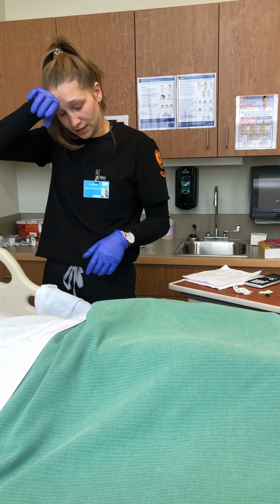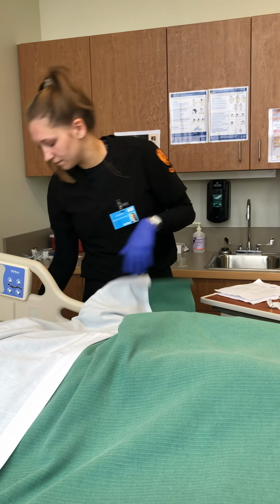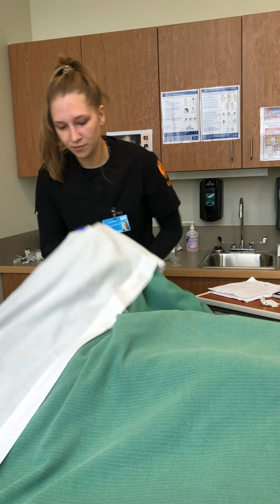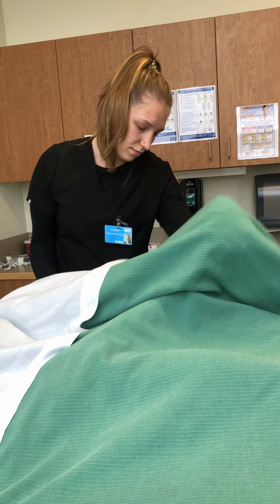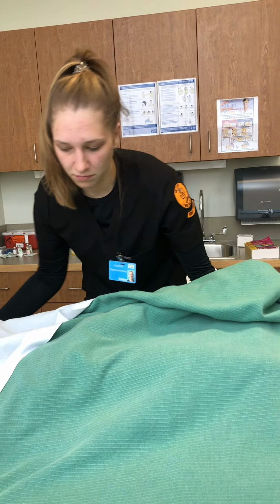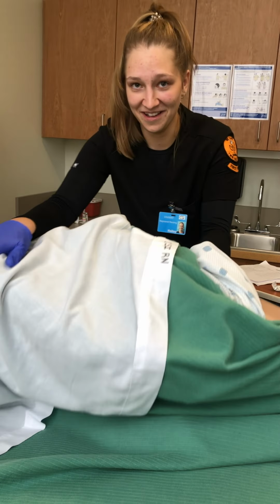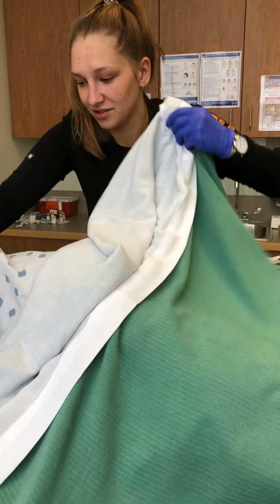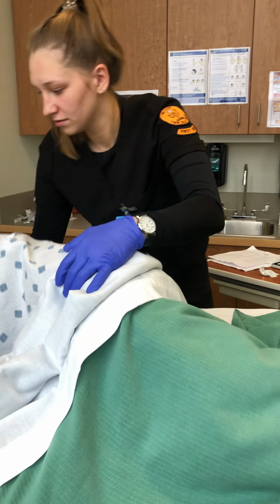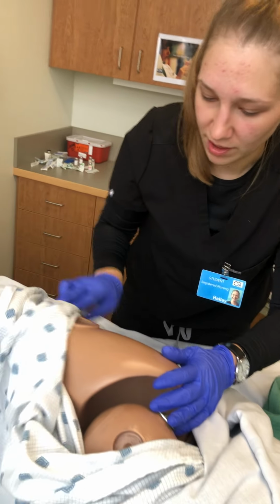I'm going to be delivering this in your ventrogluteal site. I'm going to go ahead and flip you onto your side here so I can get to the area. Okay, Betty, work with me. Okay. Please don't fall. Okay, so I'm going to be exposing the area I want to be working with.